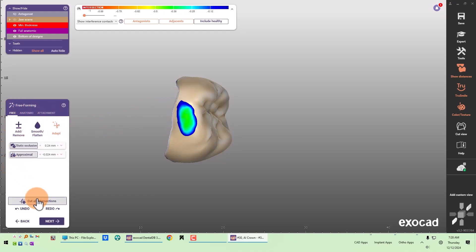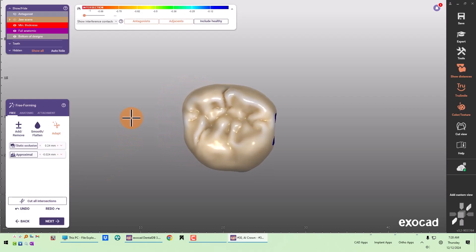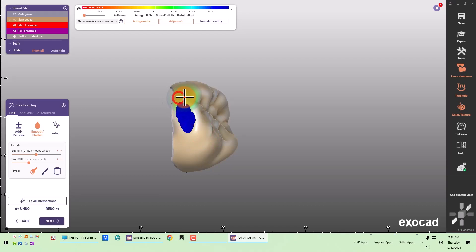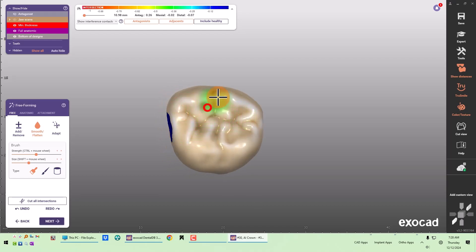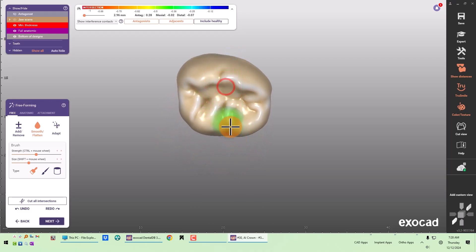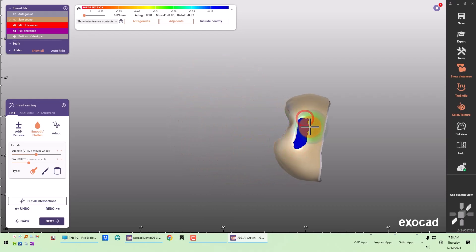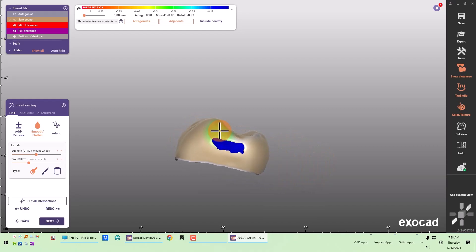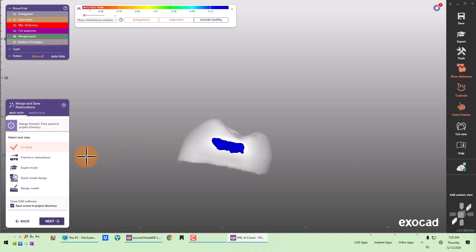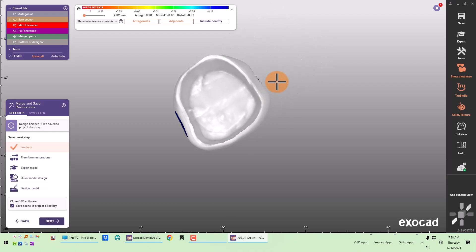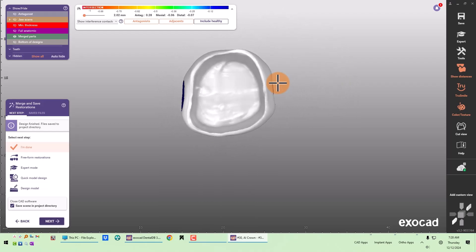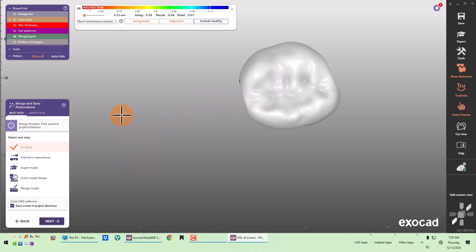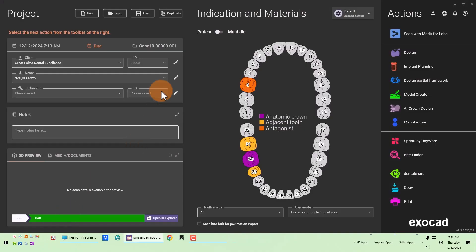Then I adapt. I could have skipped all of this, but these are my final design steps. Because my milling unit isn't going to mill in all of that anatomy, I just do a quick smooth over the occlusal surface to mill it more efficiently. Finally, I look at my emergence profile and margin profile, and that's it. The AI crown design really saves a lot of time — I don't have to do any adjusting or morphing of the anatomy. It looks pretty good, and then I'm done.